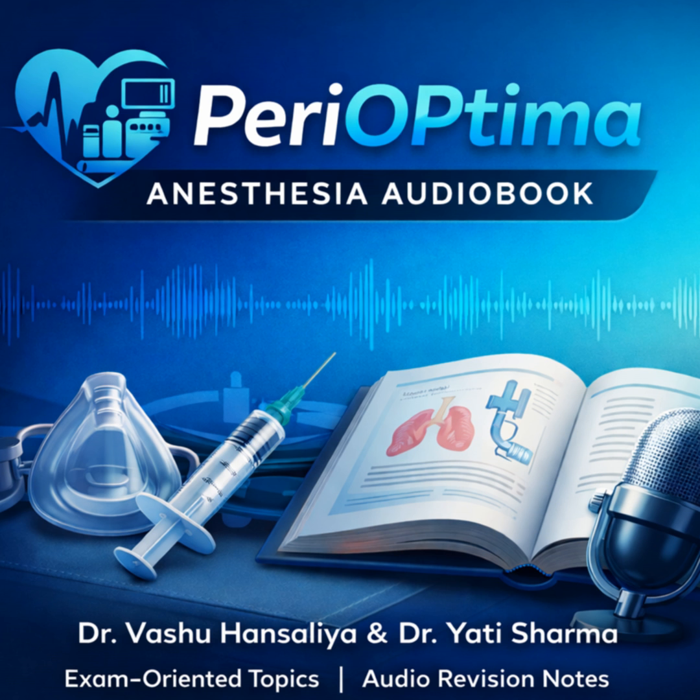machine. So PSV gives you an inspiratory push above the baseline PEEP. CPAP is just the elevated baseline pressure itself with no extra help. Perfectly put. PSV is assist. CPAP is just holding the airways open.